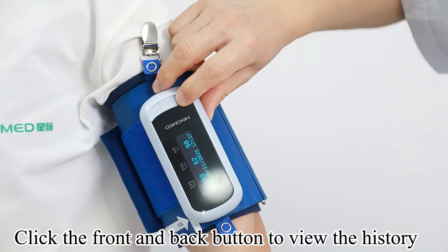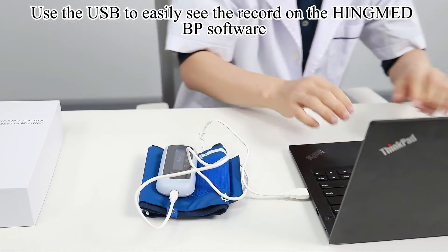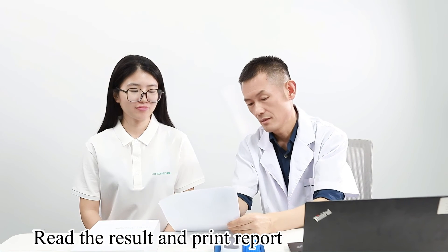Press the middle button to measure. Click the front and back buttons to view the history. Use the USB to easily see the records on the Hingmed BP software, then read the result and print the report.